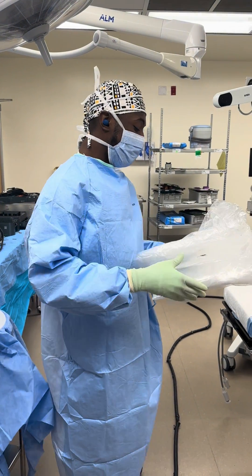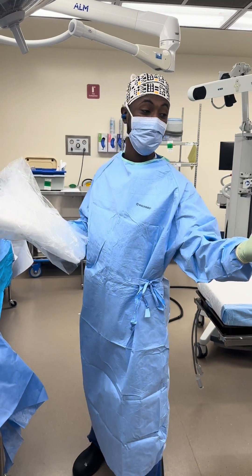It's your boy, Surgical Guru! Today we're going to show you how to register the Mako robot.